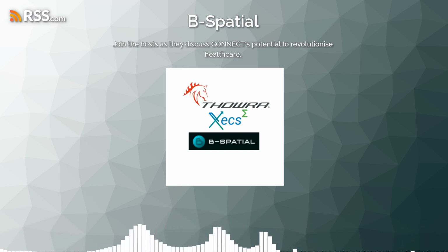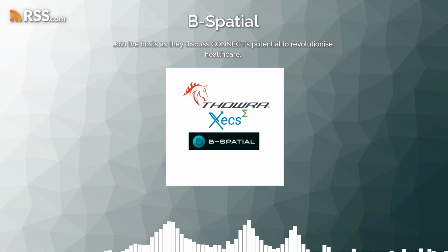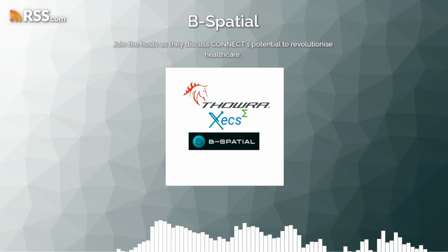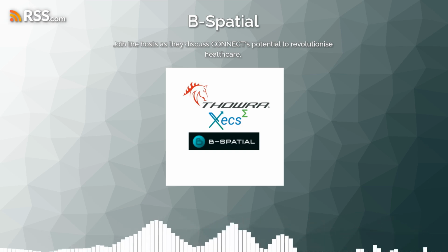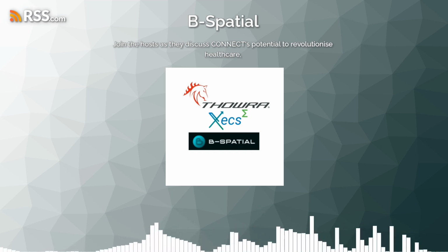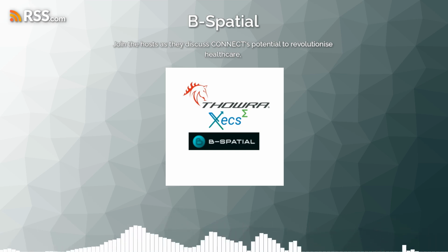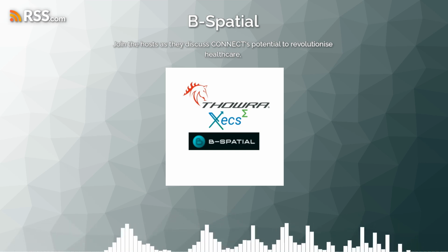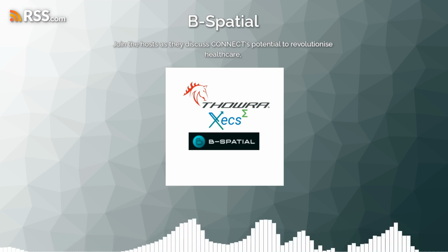And what I find impressive is that Connect doesn't just have these big, lofty goals. They've got really specific and measurable targets they're aiming for. Okay, like what? Well, we already talked about their goal to reduce power consumption by 30%, but they're also shooting for a big improvement in how accurately they can detect seizures. They want to reduce false alarms by 25%. That's huge. Right. I mean, false alarms can be super stressful for patients and their families. For sure. So how are they planning to do that? They're refining their machine learning algorithms through all that cloud processing power. Basically, they're making the system smarter and more reliable.